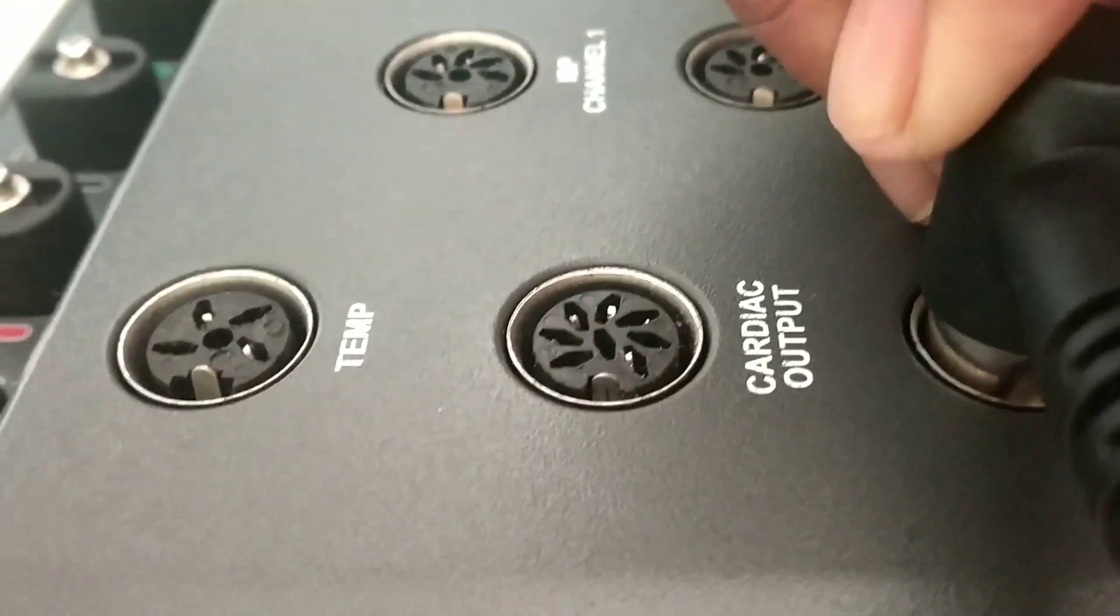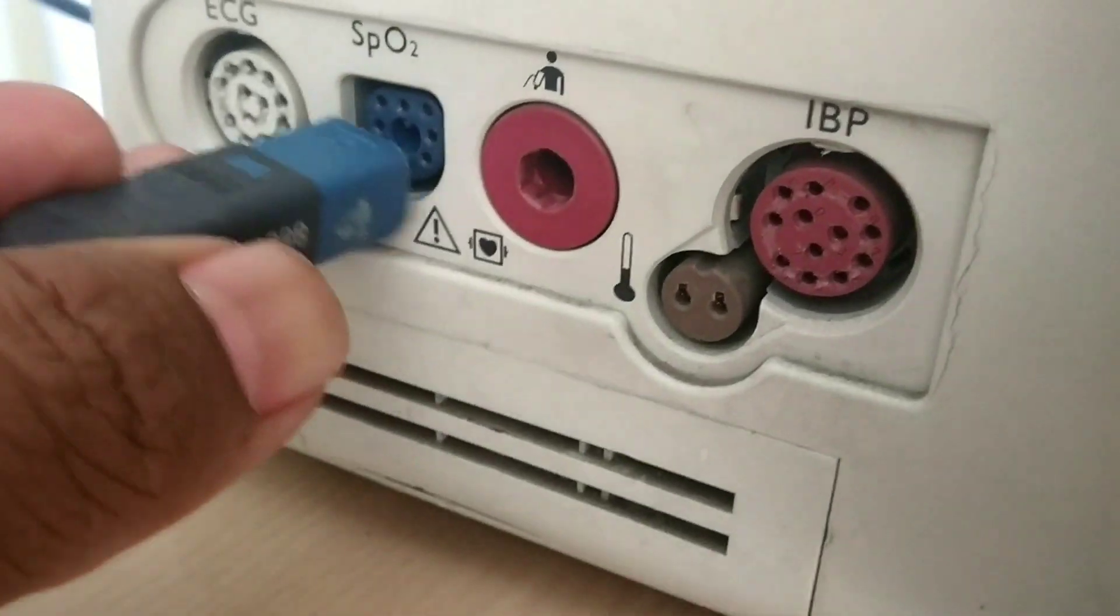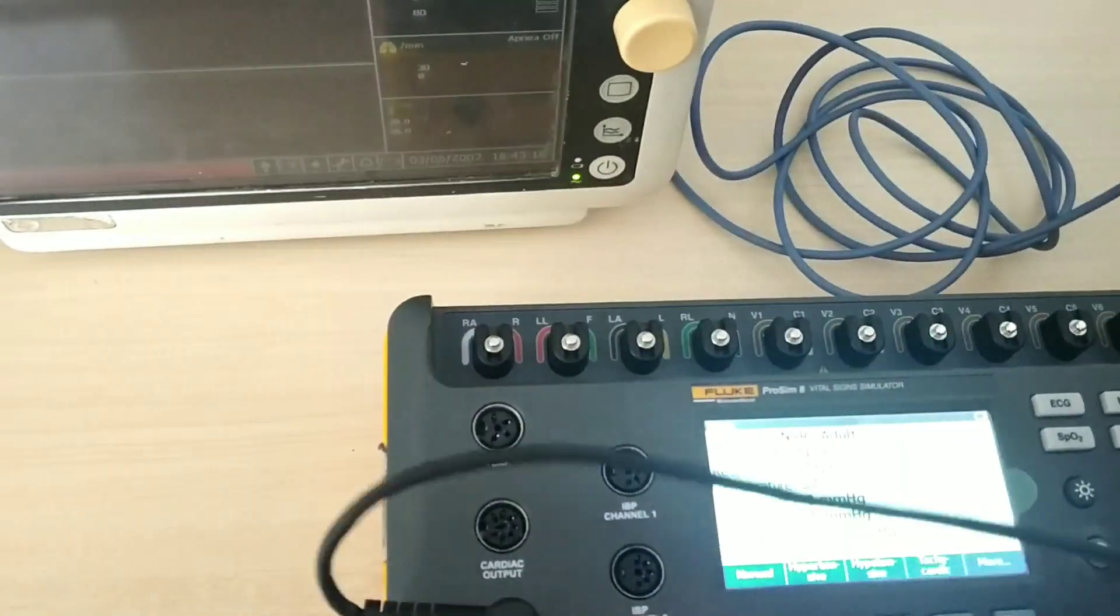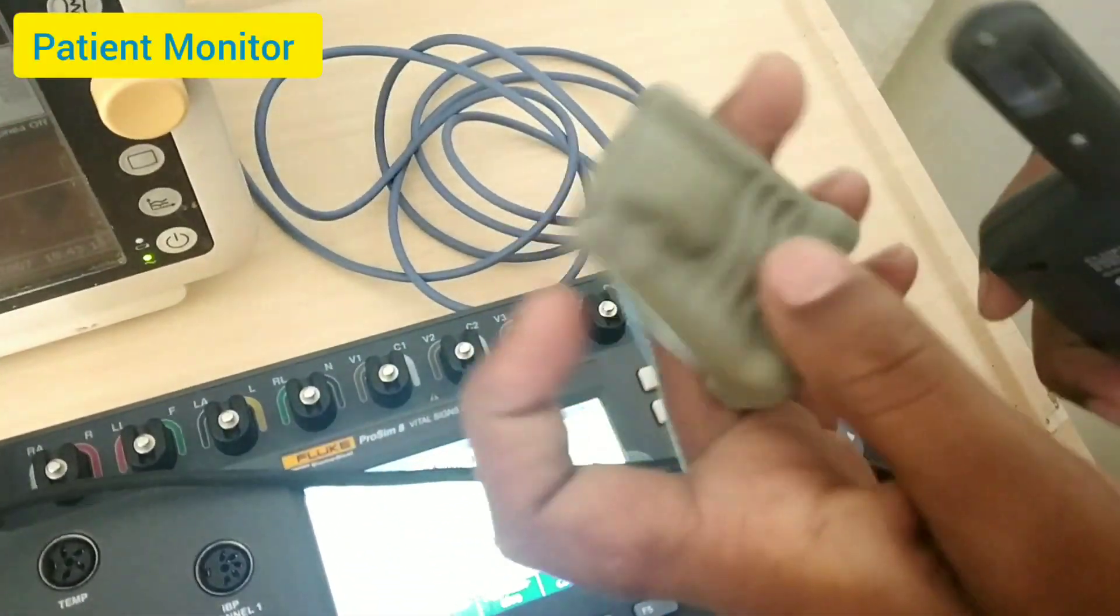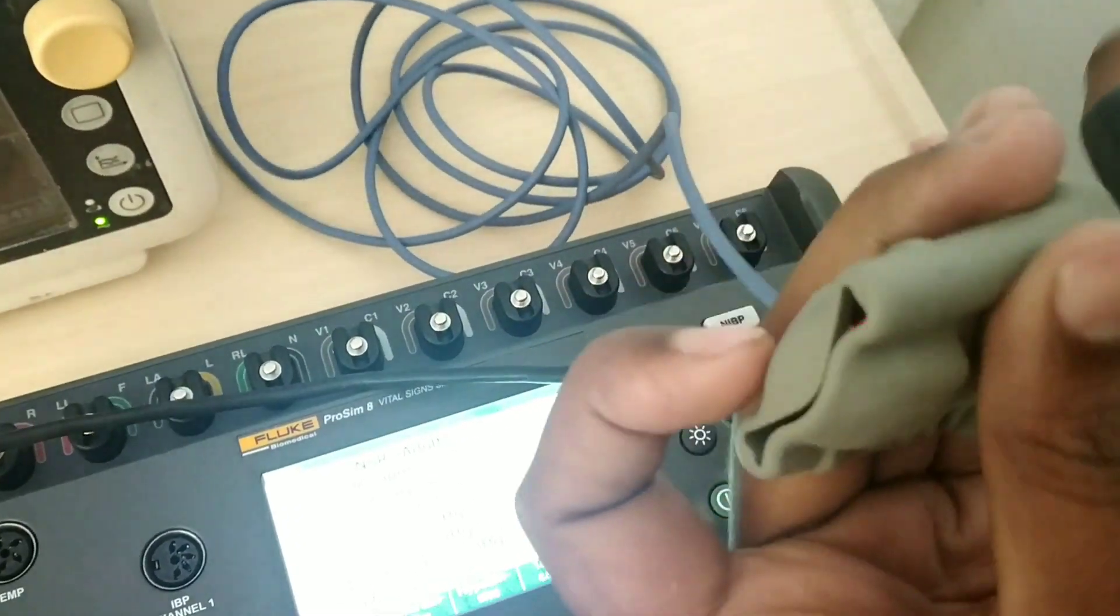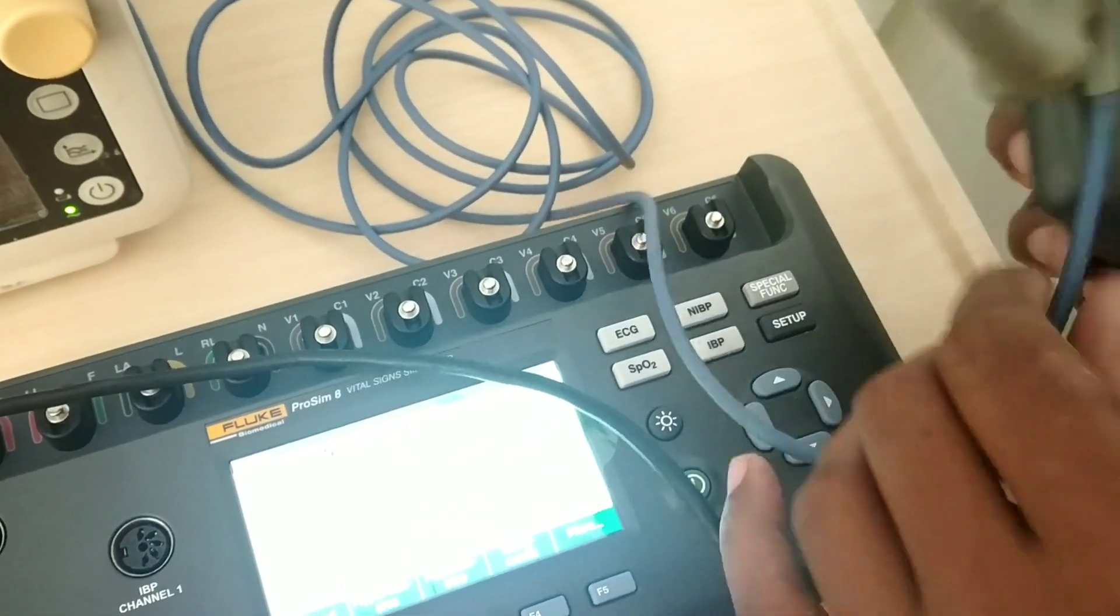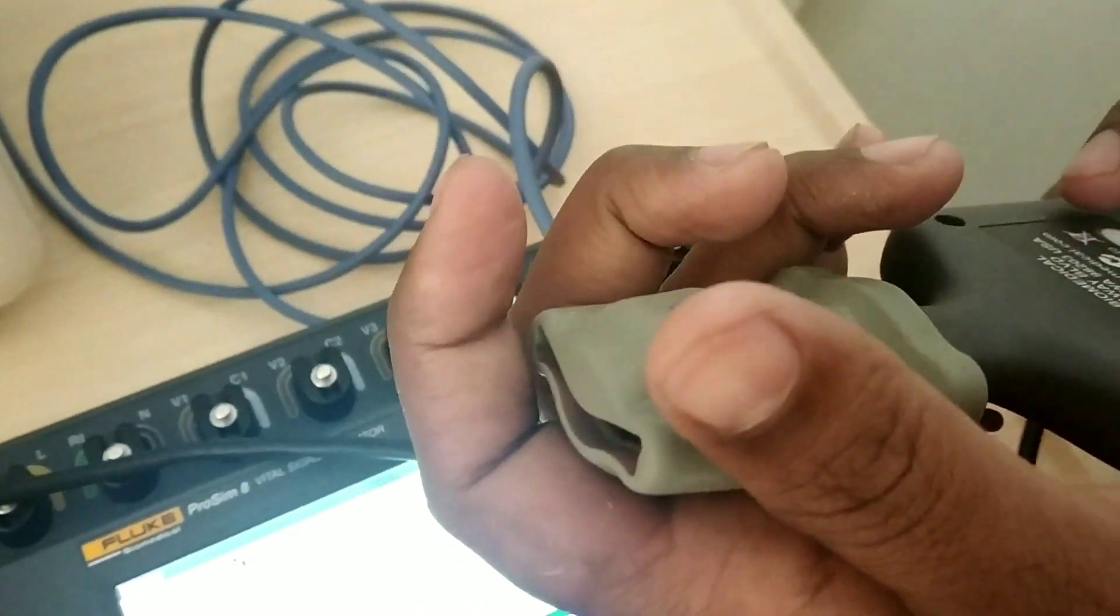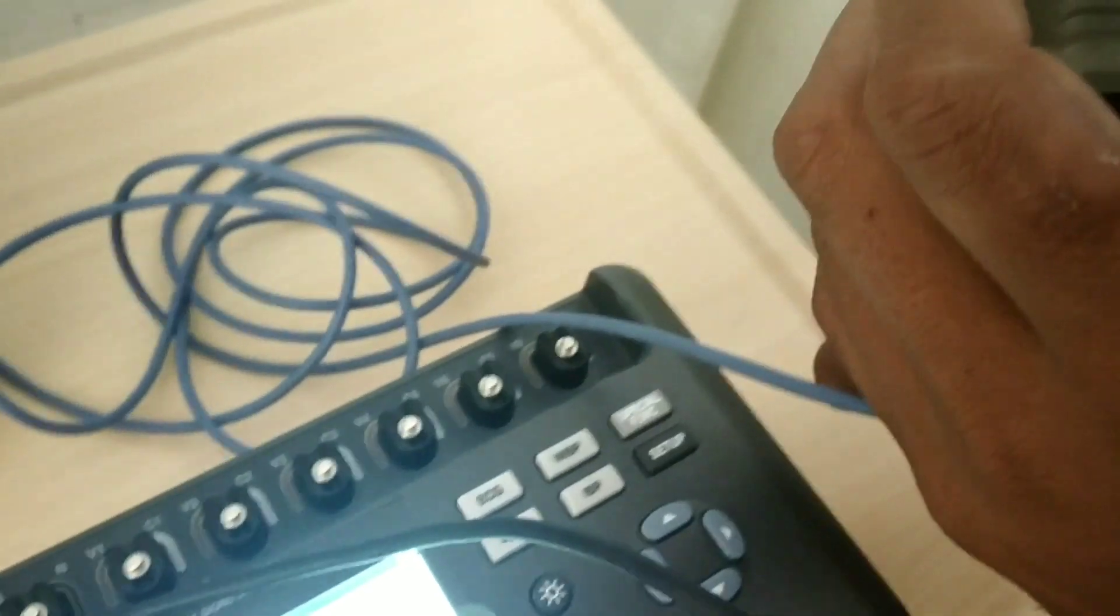Plug the simulator into the main unit. Now plug the SpO2 probe into the Philips patient monitor, Philips VM8. Now we are putting the simulator inside the SpO2 probe which will act as a finger to simulate the patient's finger. Carefully check whether everything is correct.